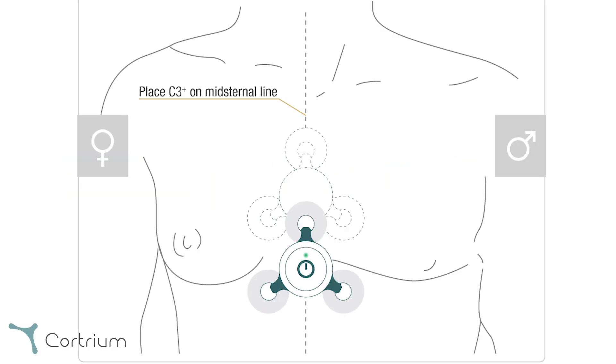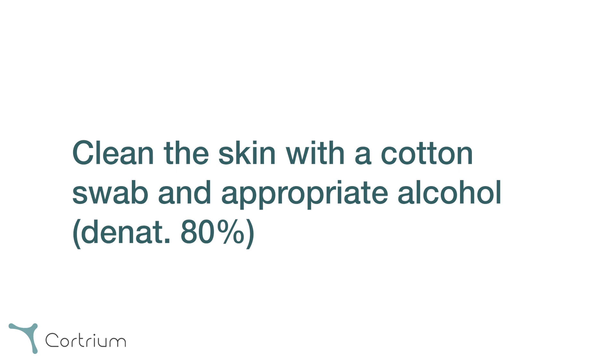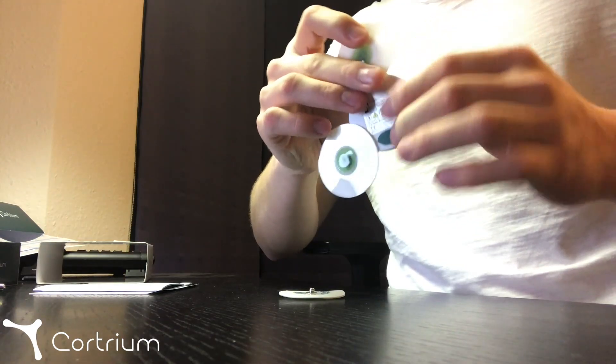First, we need to prepare the skin. The Holter monitor should be placed vertically on the mid-sternal line as shown in the picture. Please make sure to shave all hair in the area where the electrodes will be placed, otherwise the electrodes might detach from the skin throughout the recording. Continue with cleaning the skin, preferably with a cotton swab and appropriate alcohol.